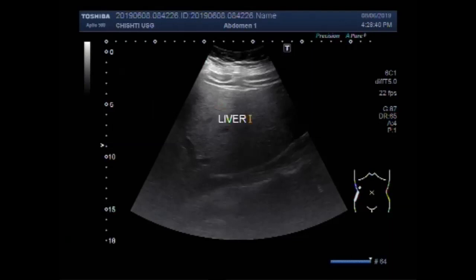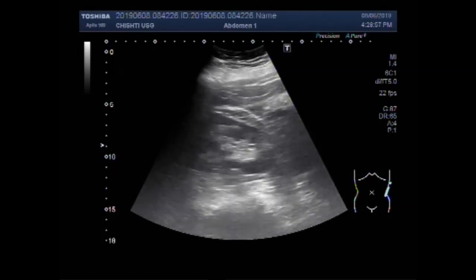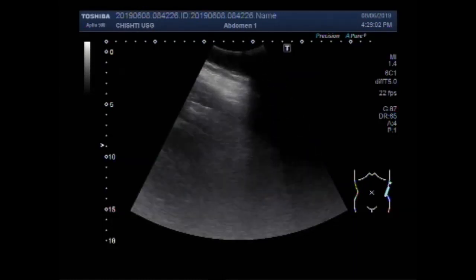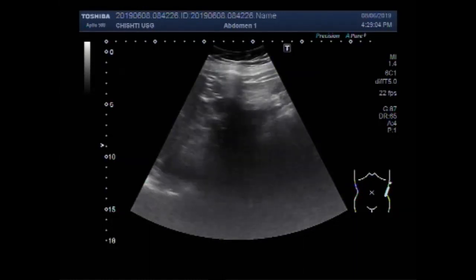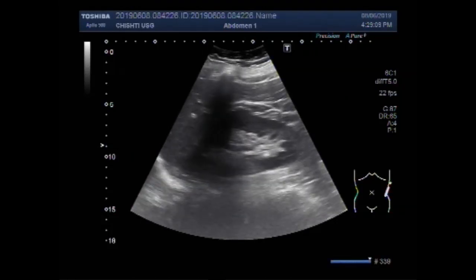This is the liver. Now you will see the left renal angle. Scanning in the left renal angle, you can see the left kidney and spleen. This is the left kidney and this one is the spleen.